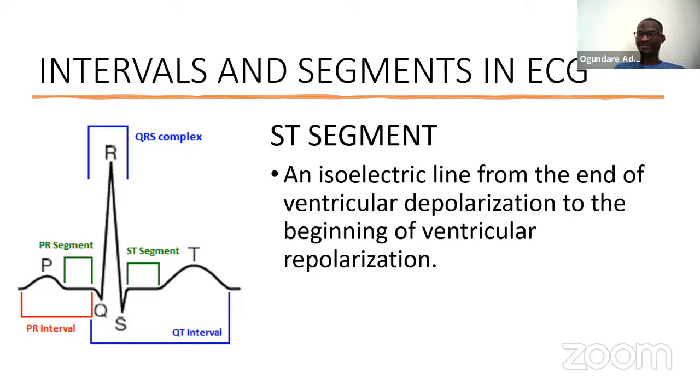Okay. The ST segment is one of the most significant components of ECG when you are talking about interpretation, because changes in the ST segments can tell you a lot of things.